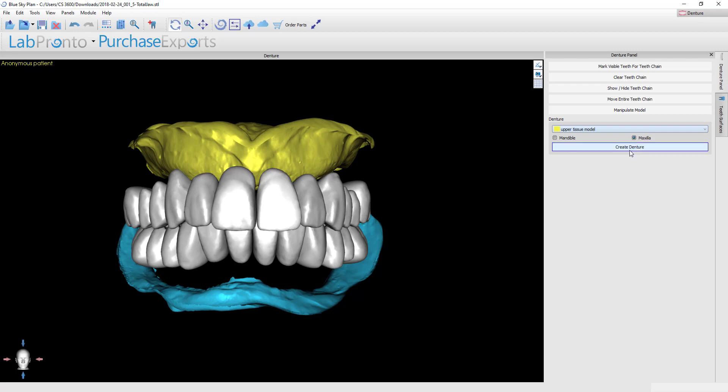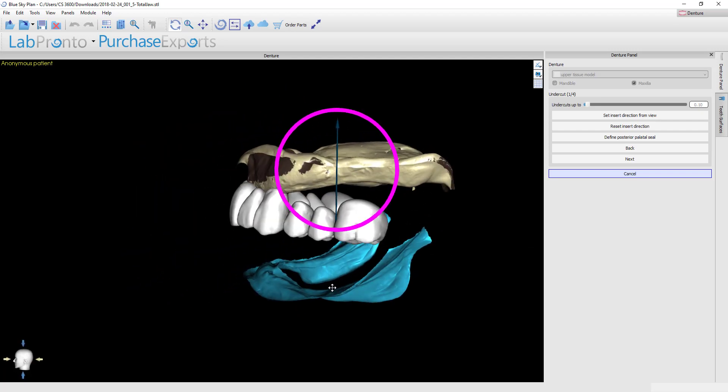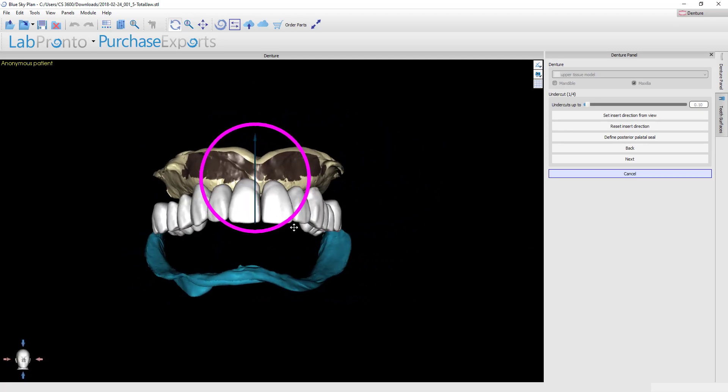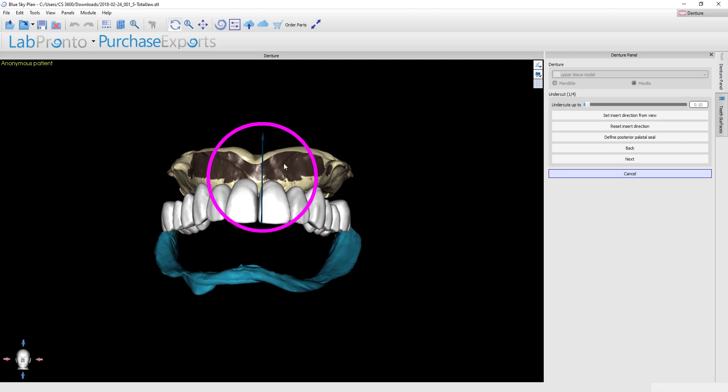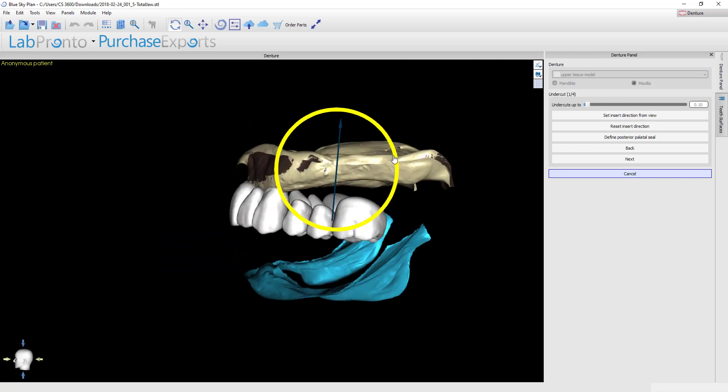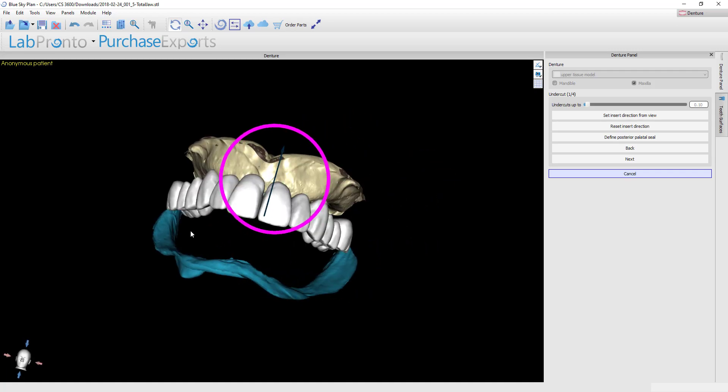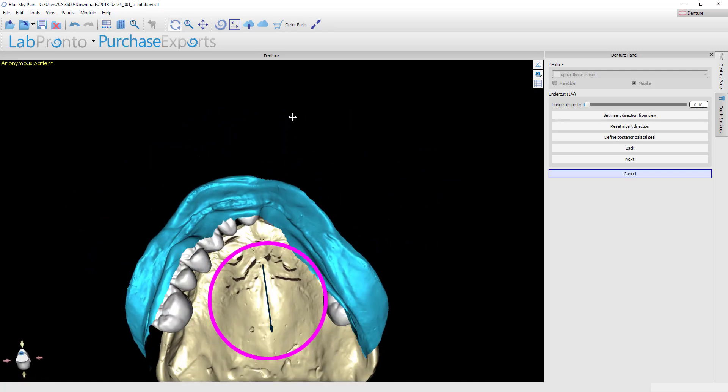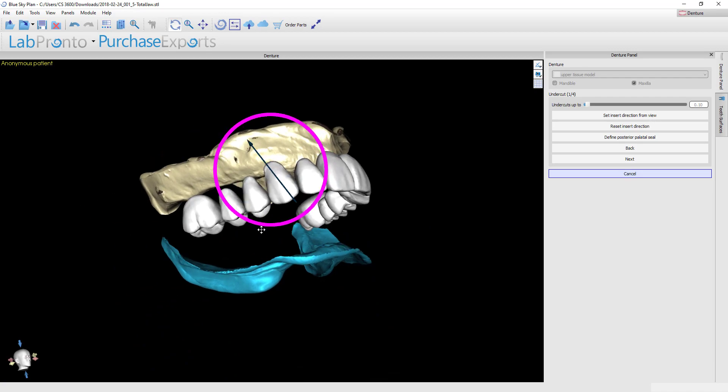So here it's a maxilla and the next button we'll hit is create denture. Now this first step is to indicate the path of draw of the denture. You'll see based on this path of draw, the dark brown is your undercuts. We can give this a little bit more of a typical insertion path for a maxillary denture, coming from the front of the mouth and going from front to back. By doing that, we've minimized how much undercut there is.